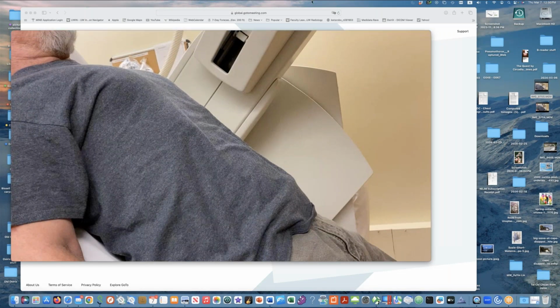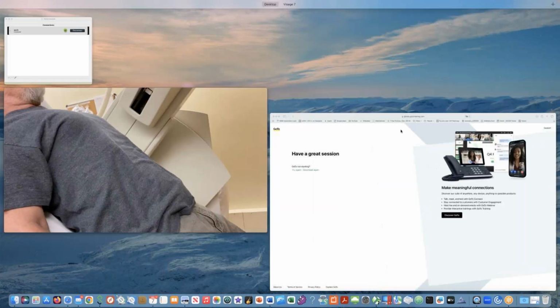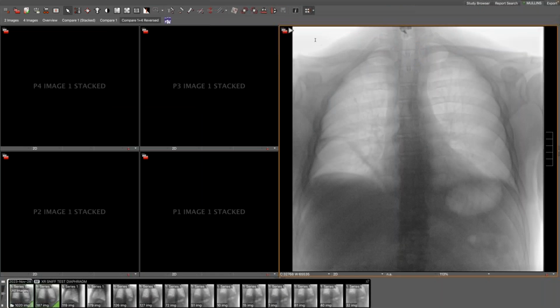So, all right, Jeff, I'm going to stop there because I'm going to unfortunately have to get back into the reading room. Travis, can you hang on for me to show one case? Yes. Okay. All right. Better make it time. Okay. I wanted to show you this movie of a guy I did a diaphragm fluoro on. I would like actually to show you the diaphragm study first.